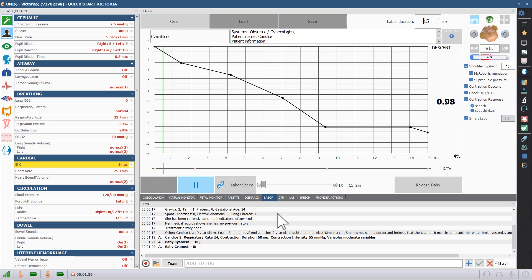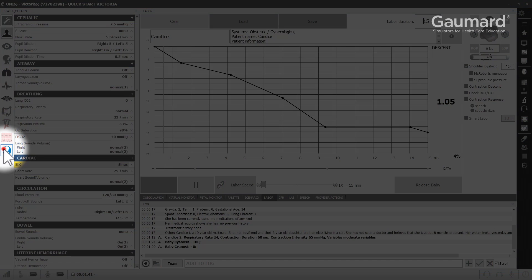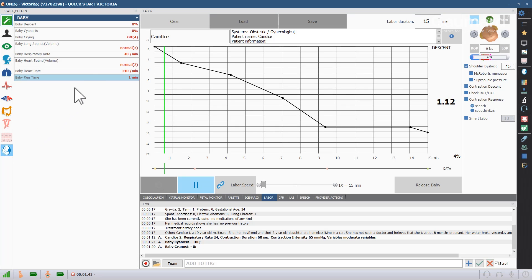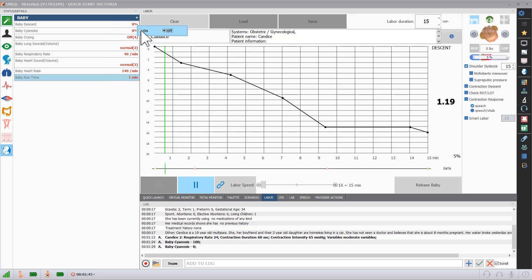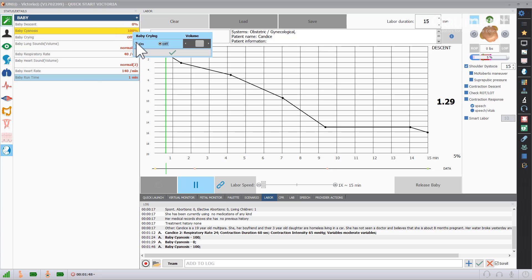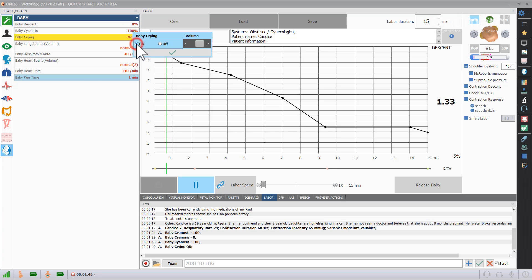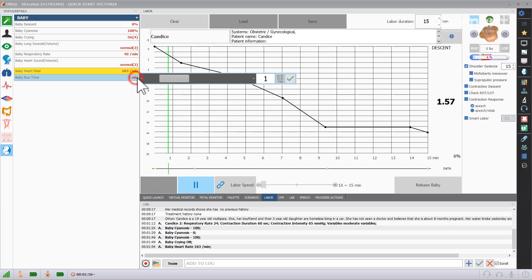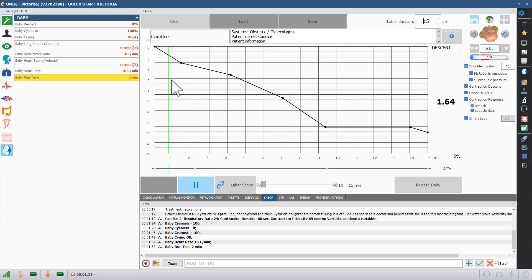To program the birthing baby vitals, click the baby icon at the bottom of the submenu list on the left. With the instant apply feature activated, you can click any of the values and make changes by clicking the buttons or moving the sliders. The baby run time determines how long the baby will play the vitals after being delivered.